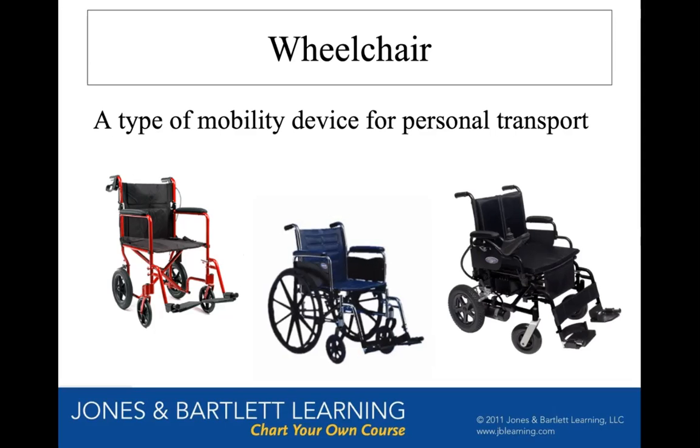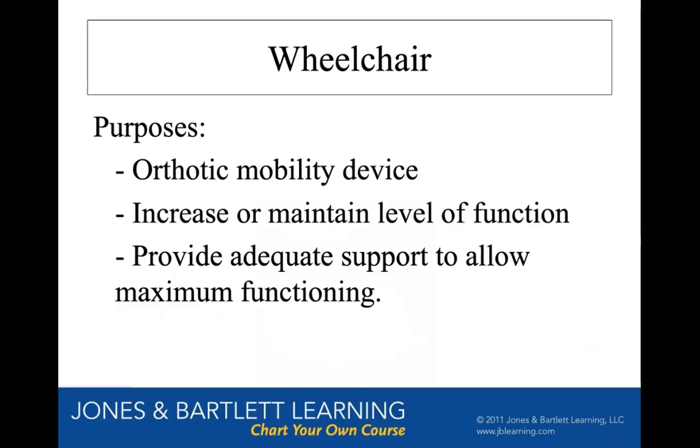Power chairs are very expensive. This basic power chair might run you about $15,000, but I've had clients whose chairs end up being 50,000, 75,000. Once you start getting bells and whistles on them, they really do get expensive. But more on that later.